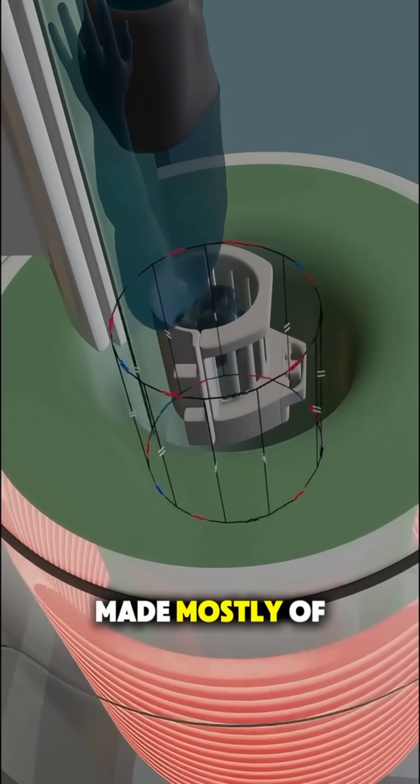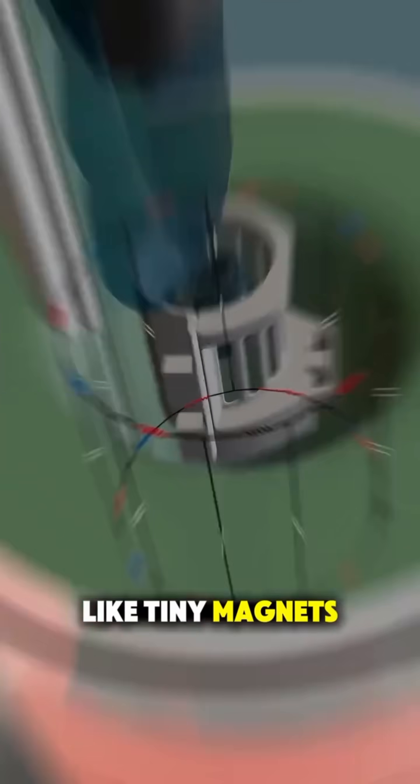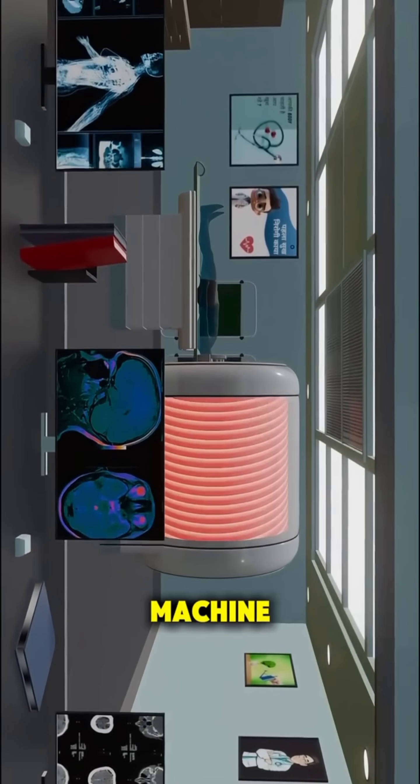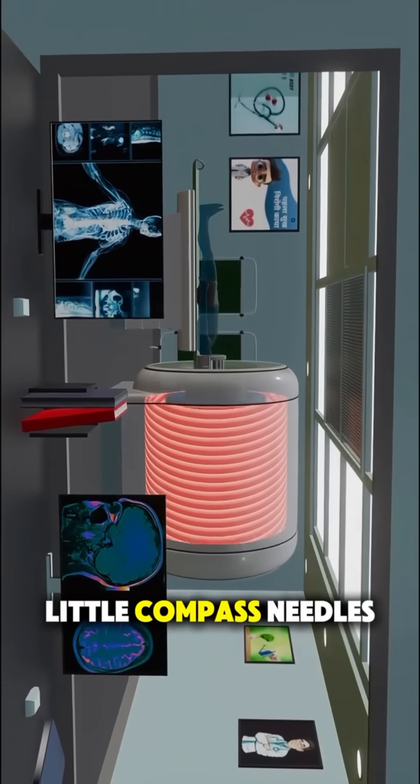Your body is made mostly of water, and water contains hydrogen atoms that behave like tiny magnets. When you lie inside the MRI machine, its strong magnetic field makes those atoms line up like little compass needles.